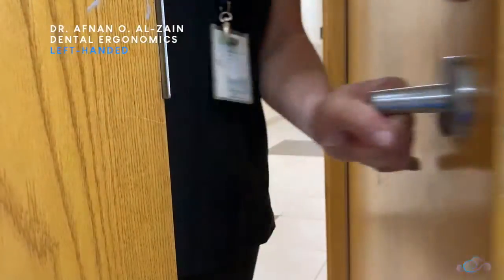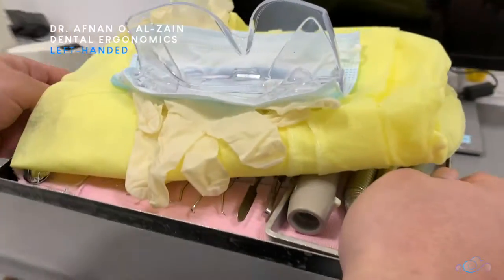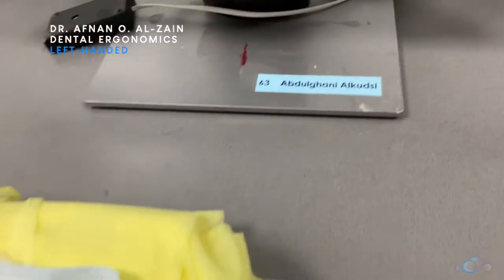Once you enter the sim lab or the phantom lab, you're going to receive your instruments and then head to your unit and make sure that you are sitting in the unit with your name on it.